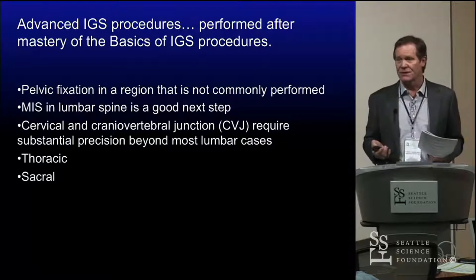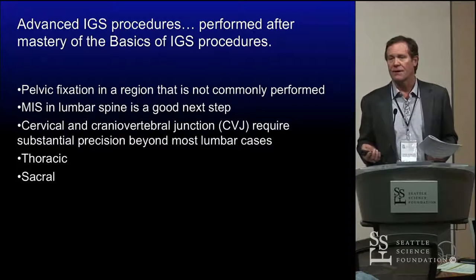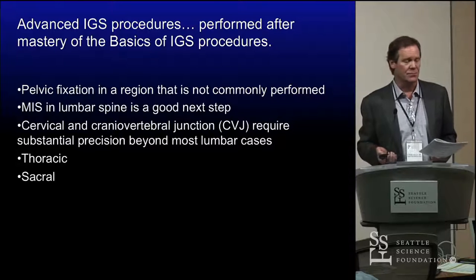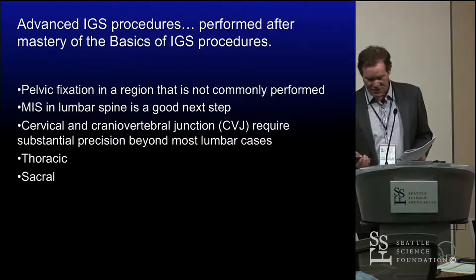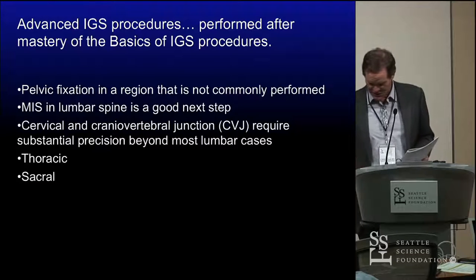What are some of the advanced procedures that we perform? Pelvic fixation is a key part of any big spinal reconstruction we do these days with long fusions. You have to have pelvic fixation. We use image guidance for that. We find it a lot easier. We can still put screws in without it.